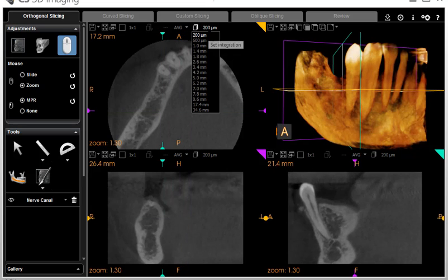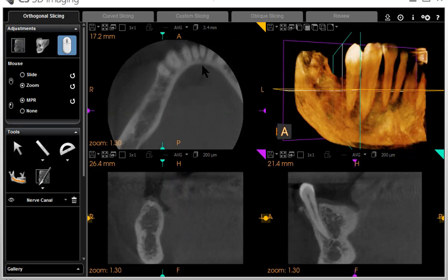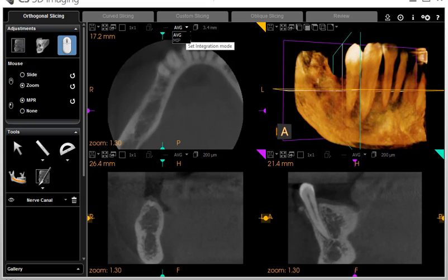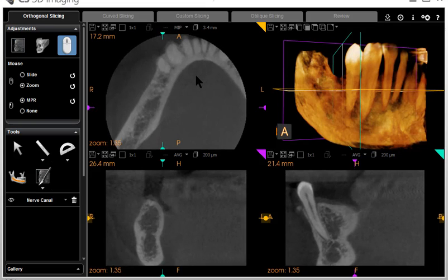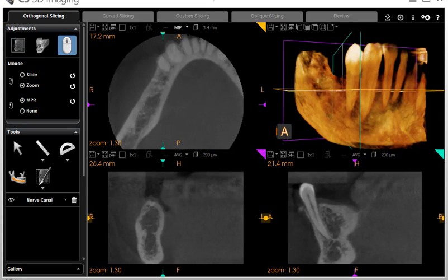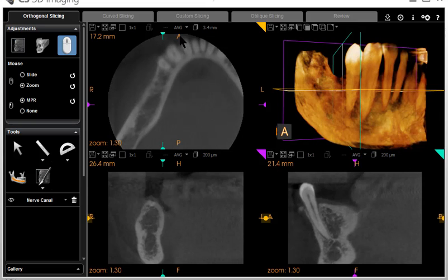This is the width of the slice. If you want to thicken the slice, you do that. Usually if you thicken it, you need to change it to MIP from average.